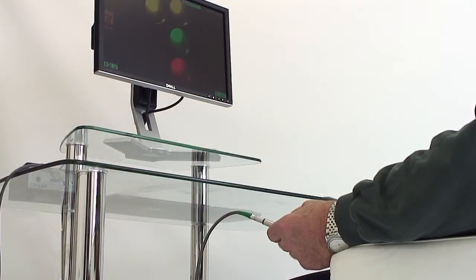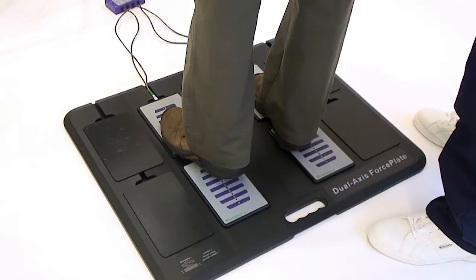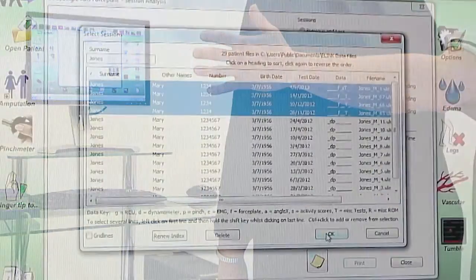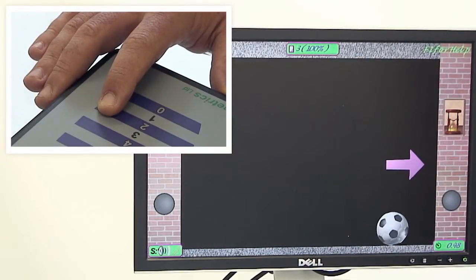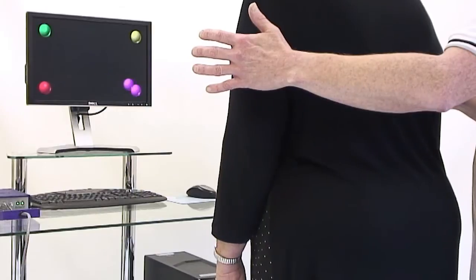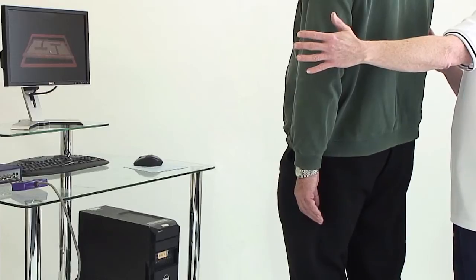Exercise can also be undertaken with all the gradable activities. E-link force plates provide the means to assess how well the stroke patient can maintain their standing balance on a static surface, with immediate biofeedback for the patient, and progress reports can again be easily created. The force plates are very adaptable, using a single one for fingertip exercise through to all four force plates being utilized for balance retraining exercise, muscle strengthening and neuromuscular control.